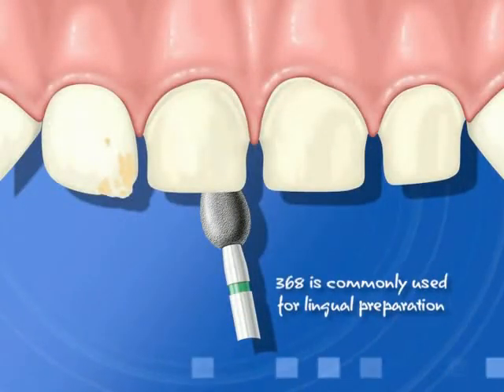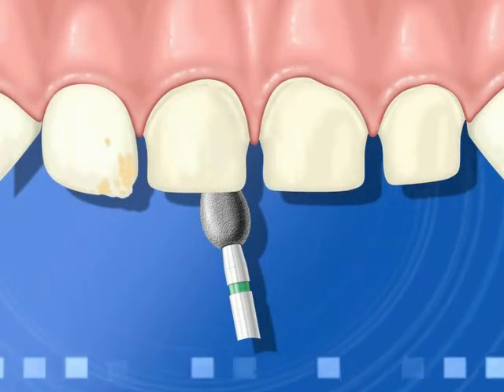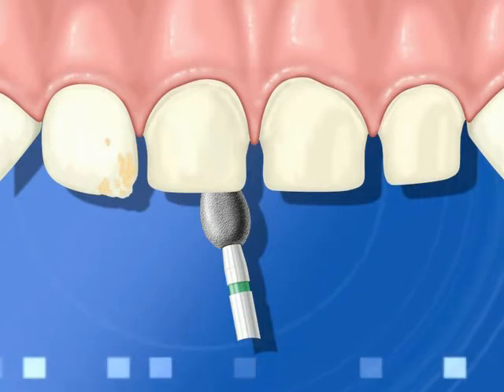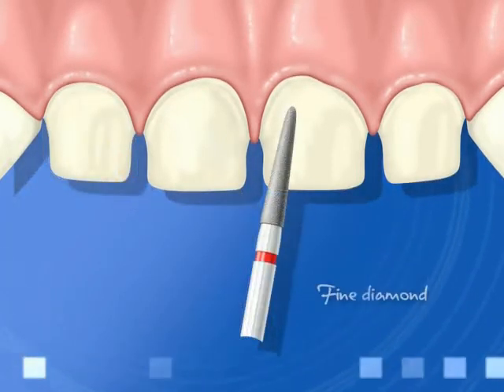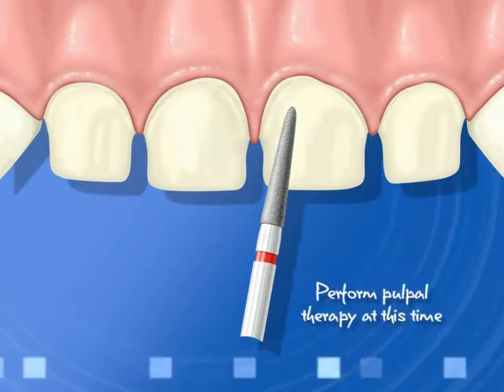A football or flame-shaped diamond such as a 368 is most commonly used for the lingual preparation. This burr can also create a nice knife edge margin, which we recommend. You can then use a fine diamond if desired to smooth out the prep, although this step is often not necessary. If you need to do a pulpal therapy, do it at this time.